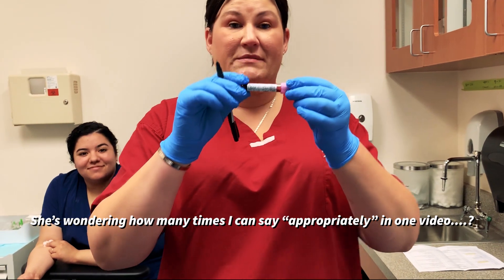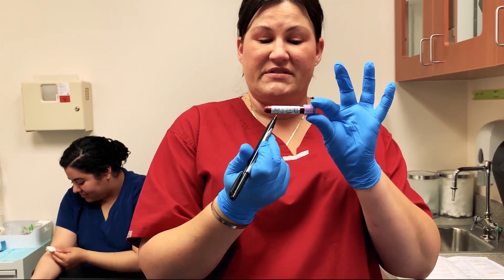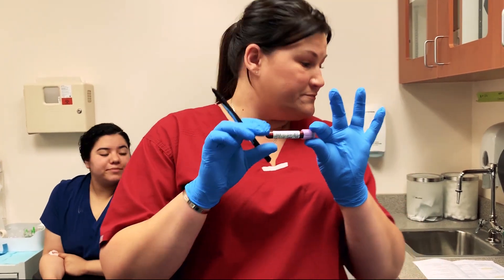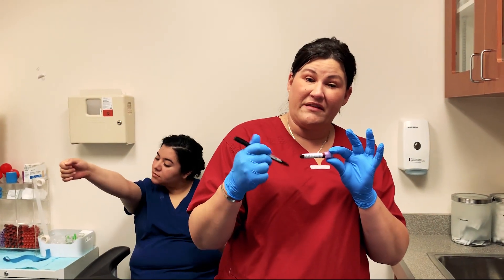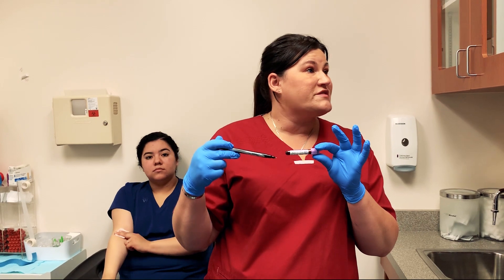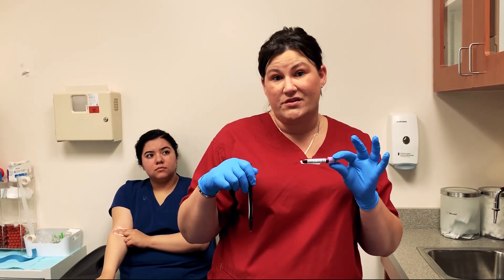You want to make sure that your specimen is appropriately labeled with the patient's last name, first name, date of birth, your initials, and the date the specimen was drawn. Otherwise it will automatically be rejected by the lab once the specimen gets there. This goes for blood, culture swabs, hemocult cards — any type of specimen that you are sending off to a lab.